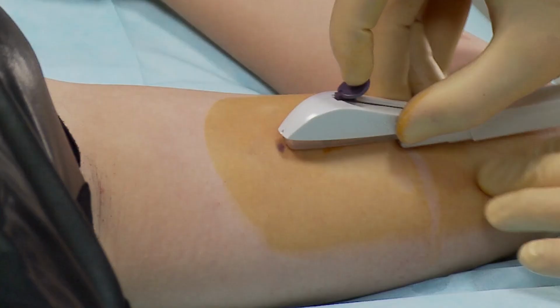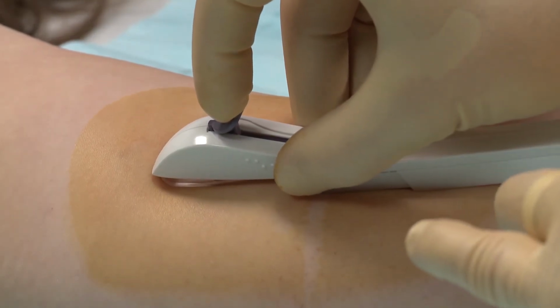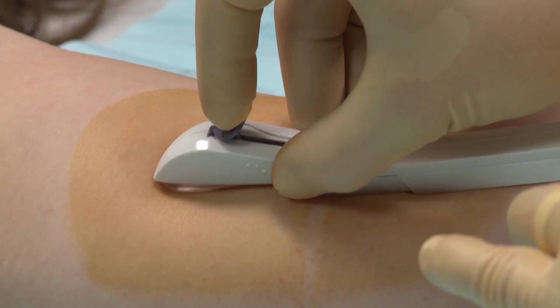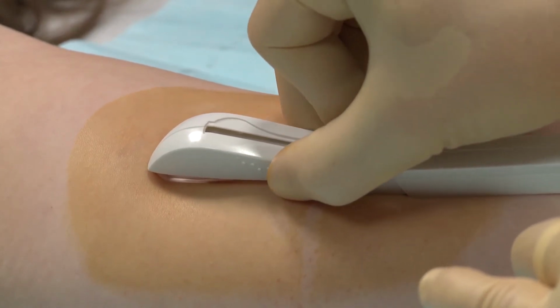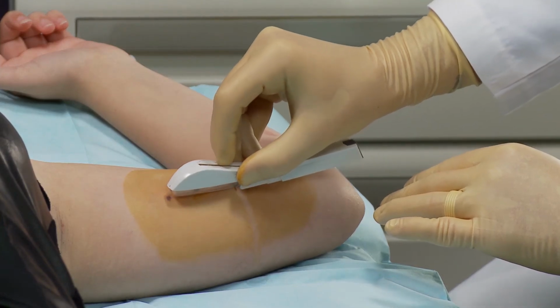Keep the applicator in the same position with the needle inserted to its full length. If needed, you may use your free hand to keep the applicator in the same position during this part of the procedure. Unlock the purple slider by pushing it slightly down. Move the purple slider back until it stops. The implant is now in its final subdermal position, and the needle is locked inside the body of the applicator. The applicator can now be removed.